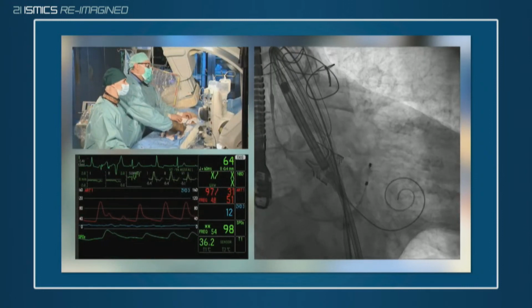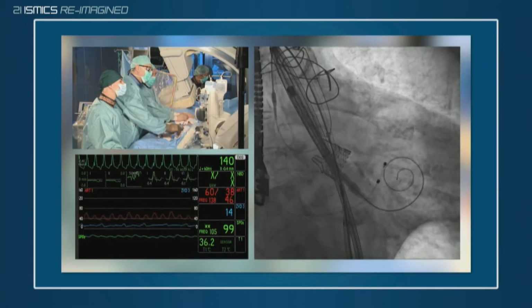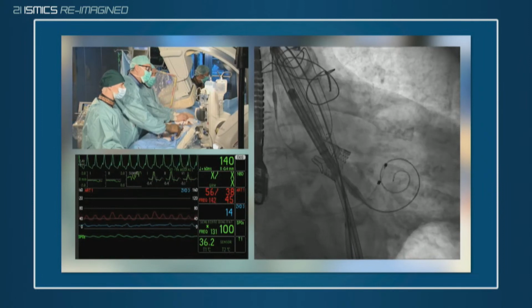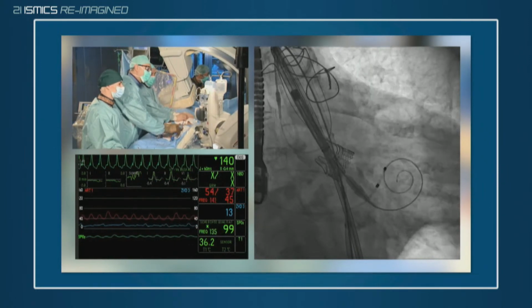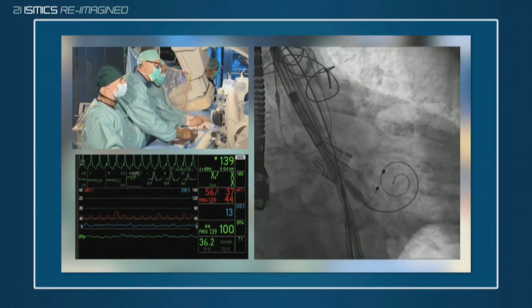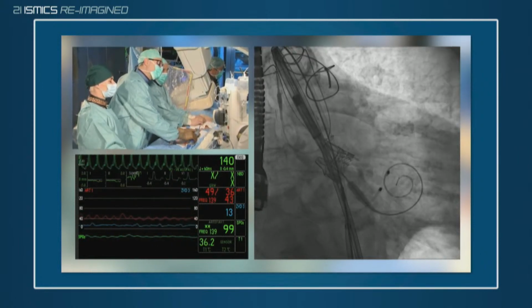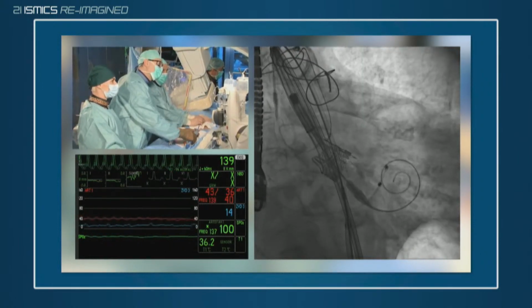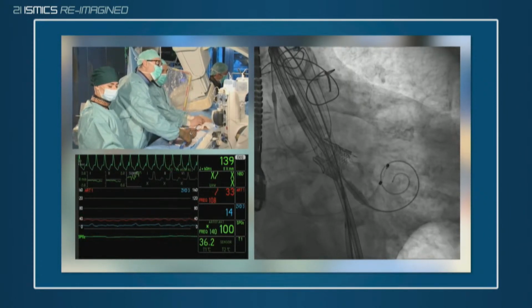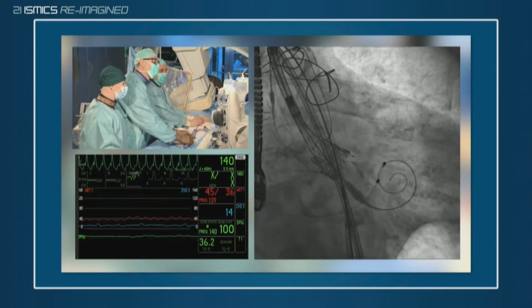Yes, we start with pacemaker 140. So here now we have it. Pulling a little bit, pulling a little bit. Okay, now we are probably where we want to be. You think it's a little low? Yeah, but it's occlusive at the moment. That's the problem with valve in valve, that you do have the occlusion phase. I think we should do it like it is.